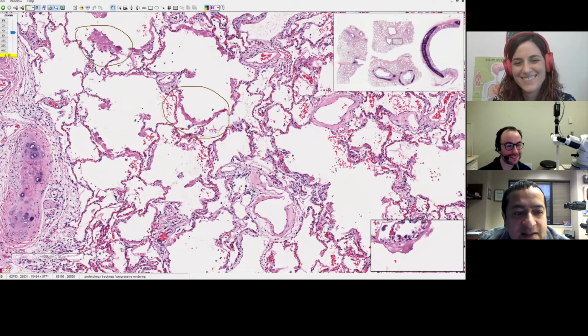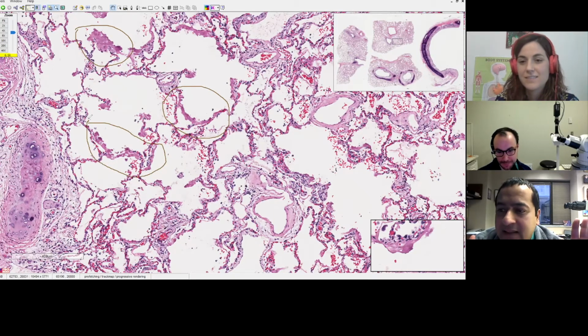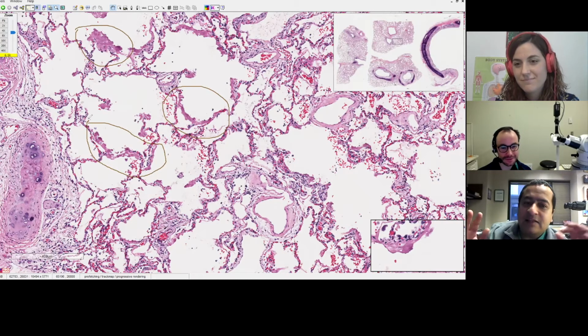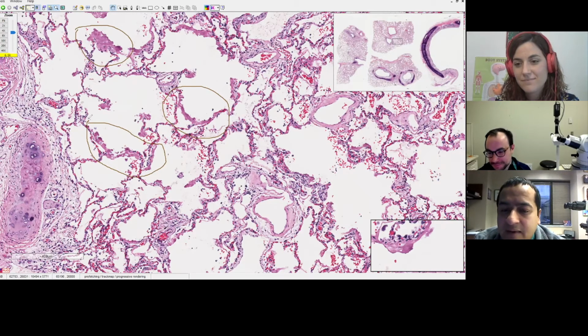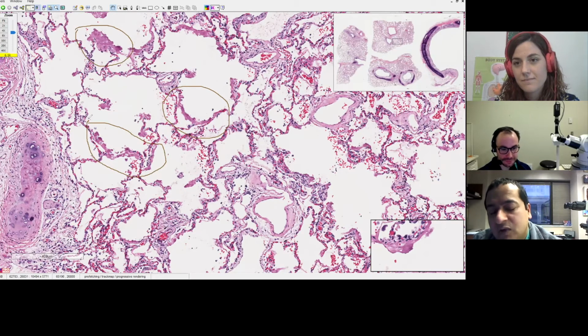Okay, so for the audience, the thing that I'm circling here is diffuse alveolar damage. And just to give you some background, this is all available free full text in the American Journal of Clinical Pathology. It's Barton et al., American Journal of ClinPath. This was an elderly gentleman who had, I believe, a remote history of splenectomy and hypertension, but no other major predisposing causes, who suddenly got sick at home and then on the way to the hospital had a cardiac arrest and died soon after in the hospital, never went on a ventilator.